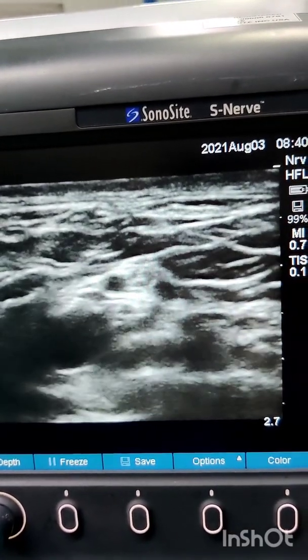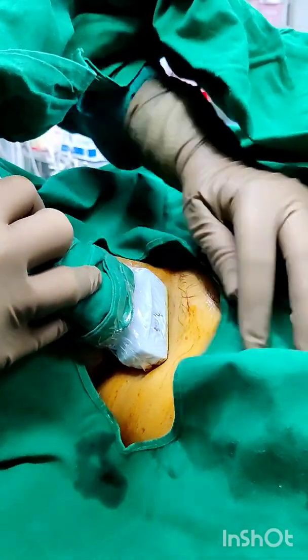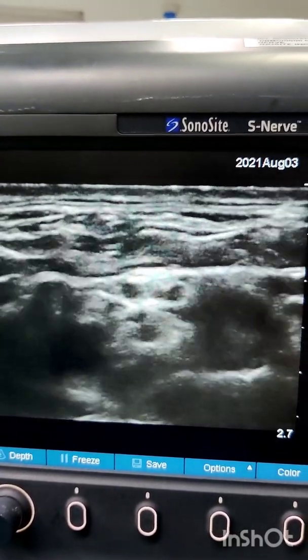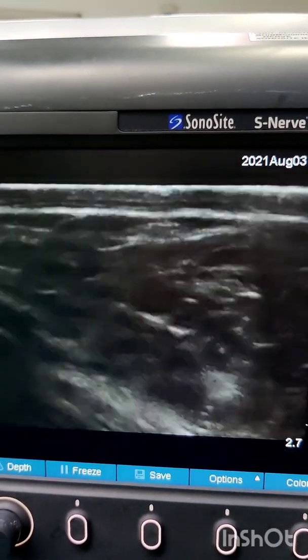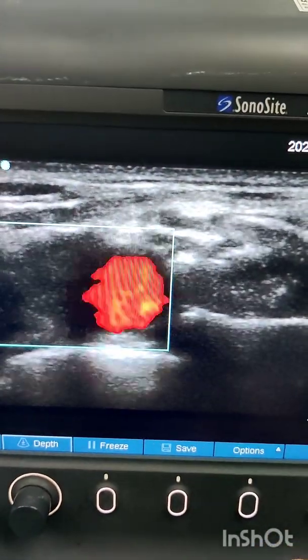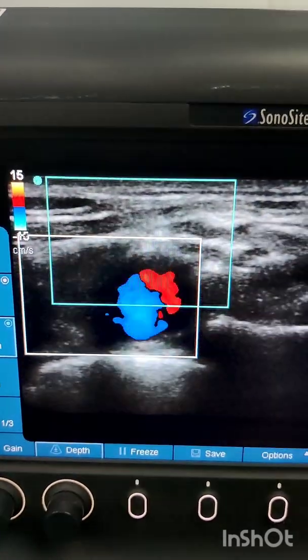Alternatively, you can directly place the linear probe in the supraclavicular fossa in transverse orientation parallel to the clavicle. In the ultrasound image, we can visualize the pulsatile subclavian artery and lateral to it the nerve cluster of the brachial plexus. A color Doppler, in addition to sonographic examination, helps us detect any aberrant vasculature. Pulsatile subclavian artery can be seen.